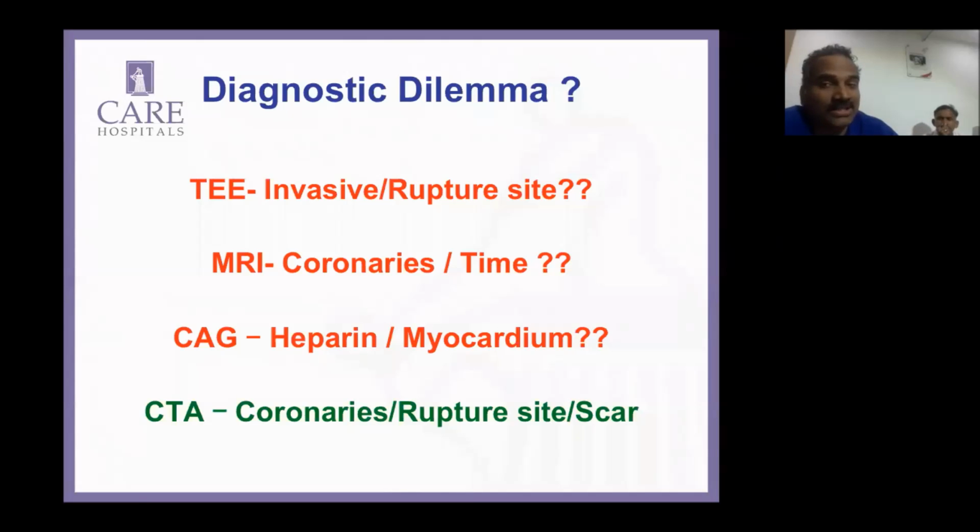Probably I'll send all those images to you, sir. It's a beautiful CT and MRI. So okay, it's a perforation. Obviously, I have to rule out perforation in this case, cardiac rupture in this case.